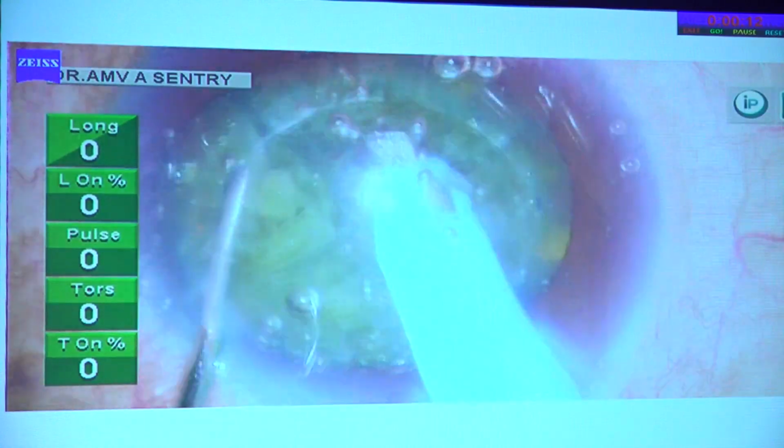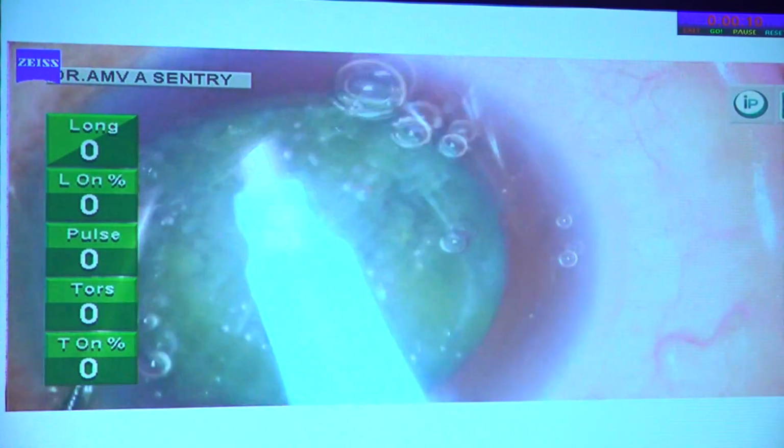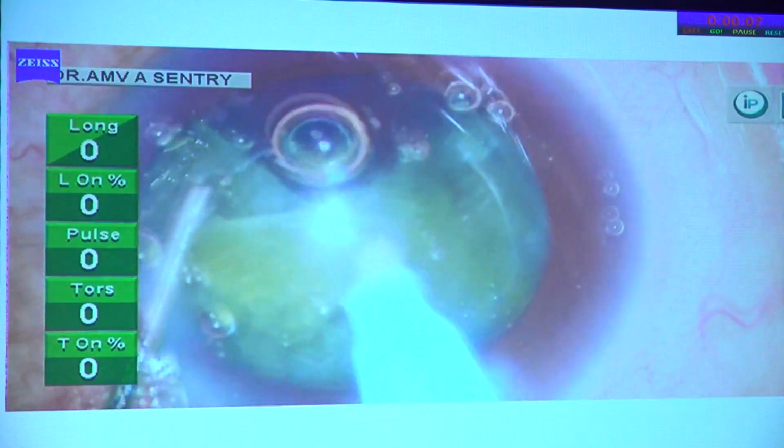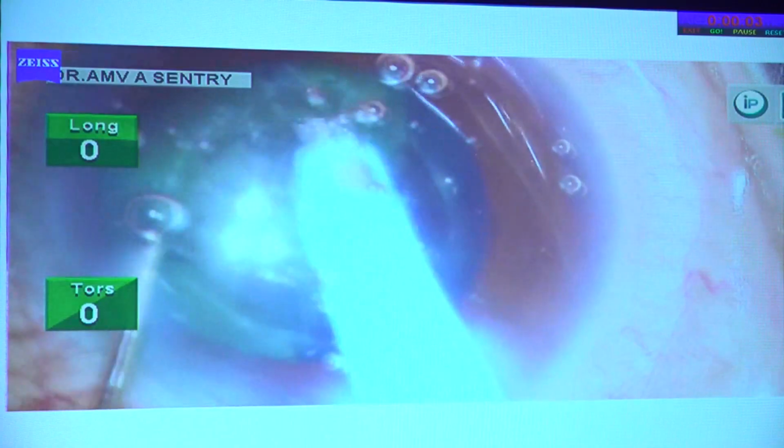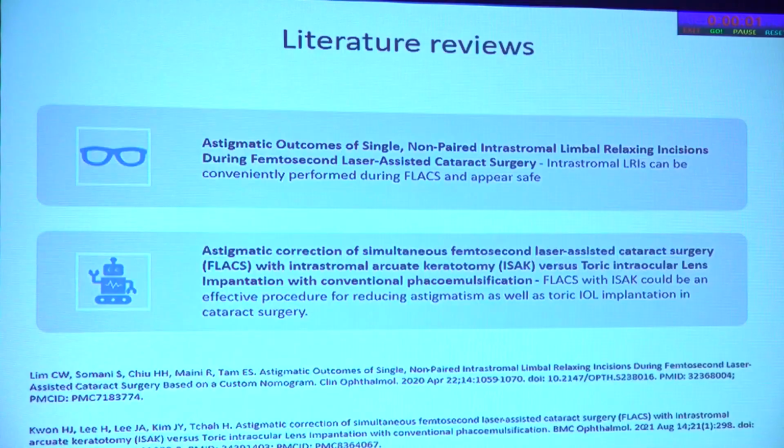As you see here, the amount of power used is quite negligible, and one can easily fragment the nucleus and emulsify it with almost no effort at all. So this is the advantage of the femto. I'm just going to skip ahead now because this is quite a routine surgery.